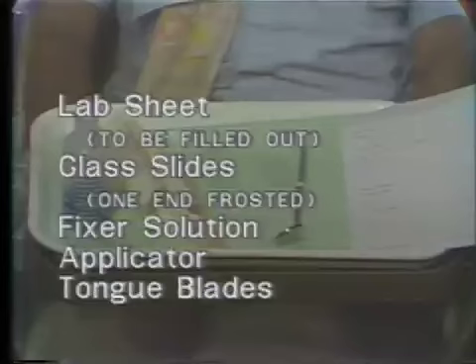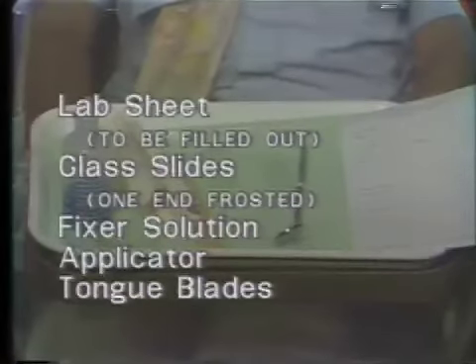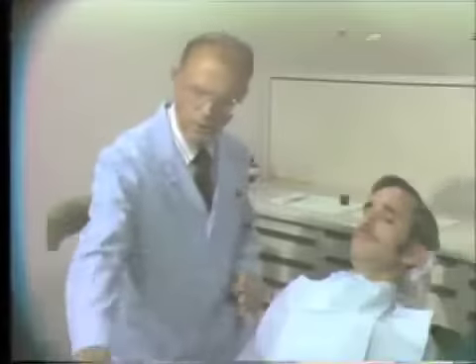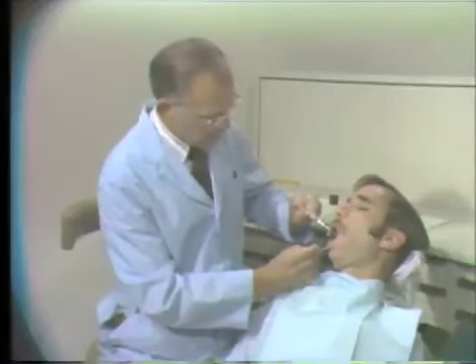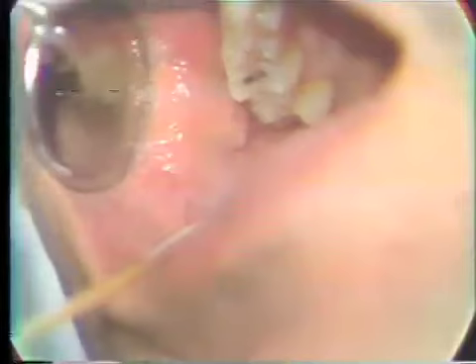A fixer solution, an applicator for the removal of the specimen, or to tidy up the area before the removal of the specimen, and tongue blades which are also used for the removal of the specimen from the surface through scraping. We'll go to our patient and examine an area from the right corner, the right anterior buccal mucosa, an area of superficial change that shows some irregularity in its periphery.